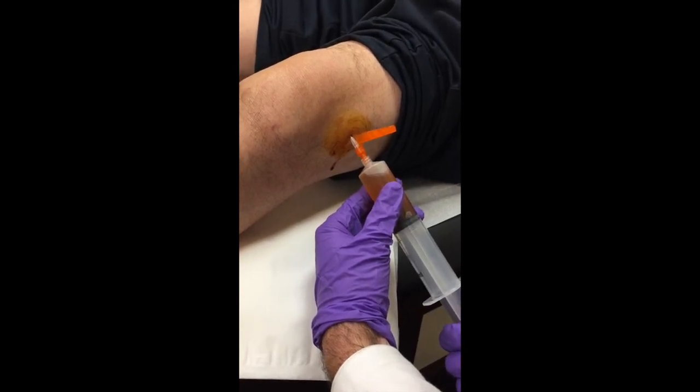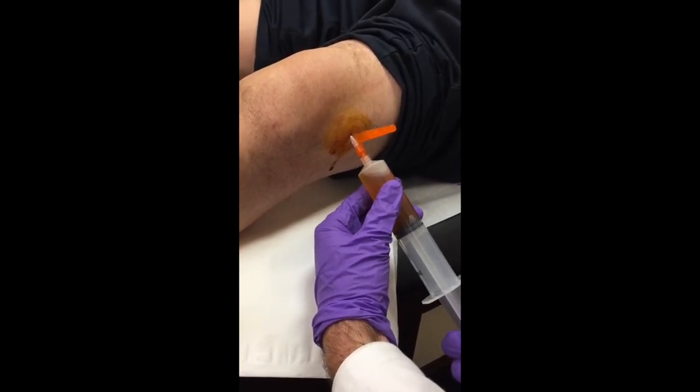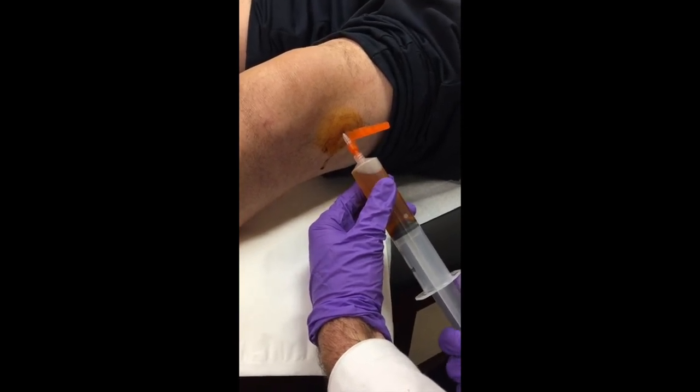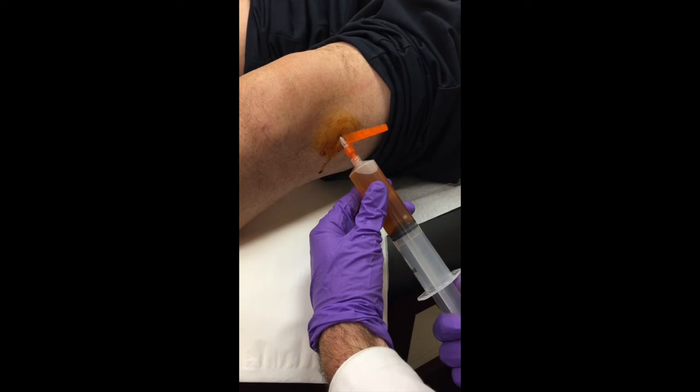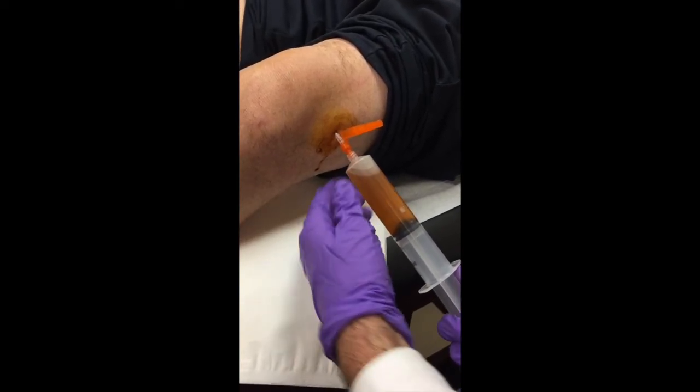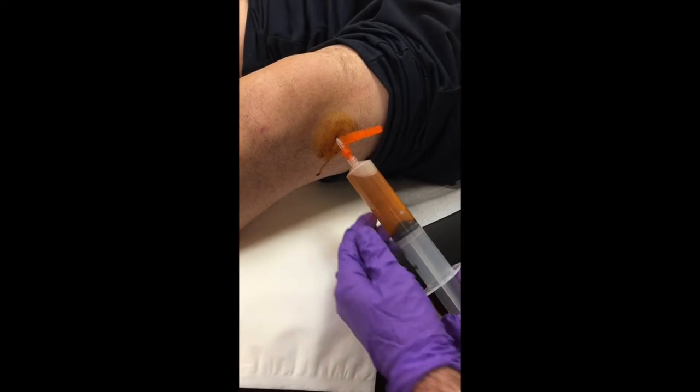If needed, slowly readjust, but for the most part just slowly keep pulling. You can see the fluid is a little darker and blood-tinged, but nothing too concerning. Now I'm creating pressure but not getting any bounce back.